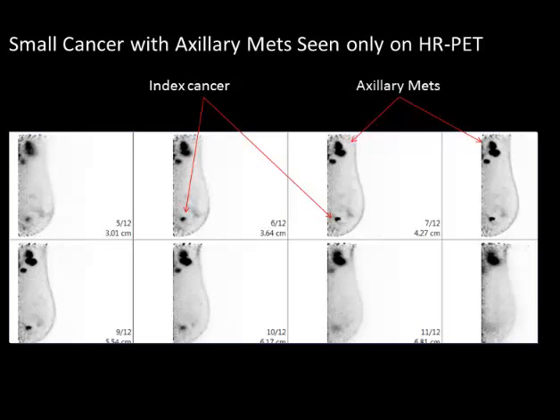This woman doesn't need the lymphoscintigraphy. She knows she's going to an axillary dissection. So we're saving her some radiation exposure and we're saving some cost. All of medical imaging is expensive. And so anytime that we can save both time, money, and invasion and radiation to the patient, we try to do that.